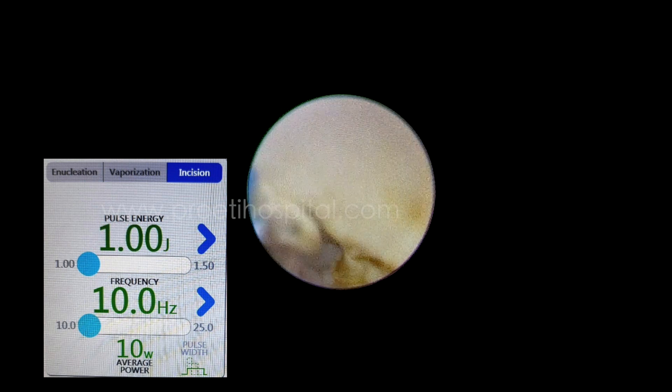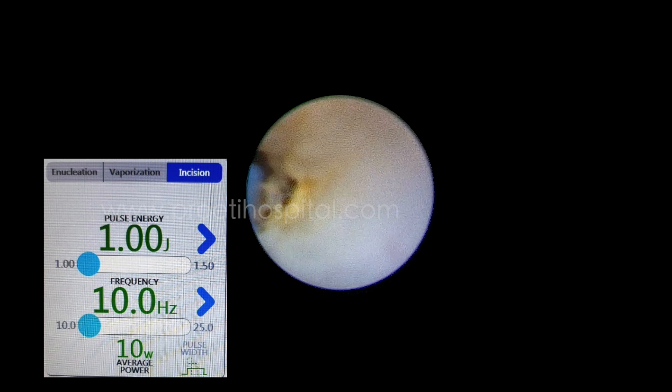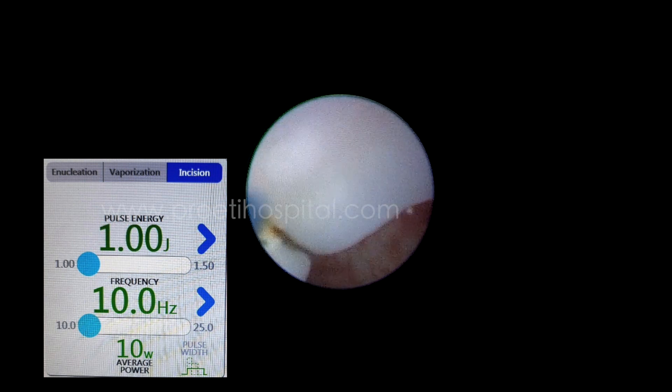This is a totally unedited video. Anteriorly you can fulgrate like this, though chances of stricture will be there. See, this is the valve. As you do small fulgrations you will understand where the curvature of the flap is turning anteriorly.